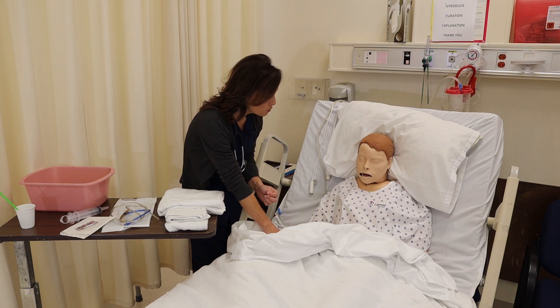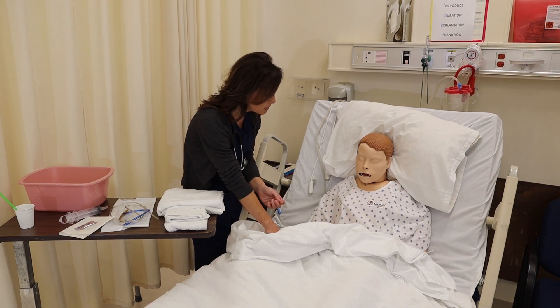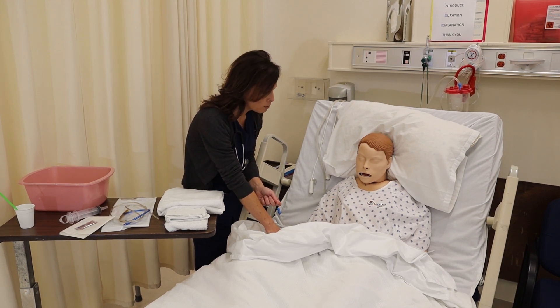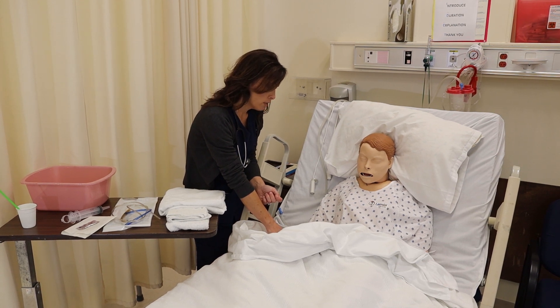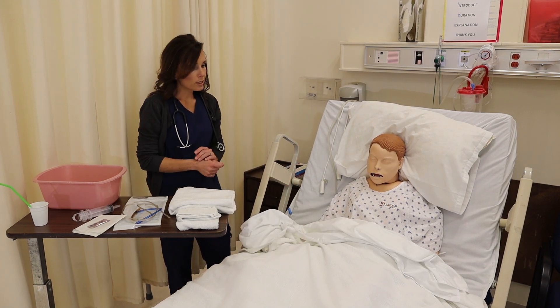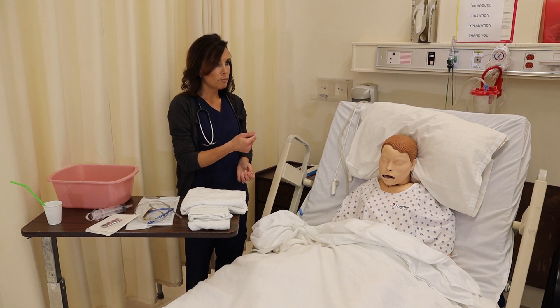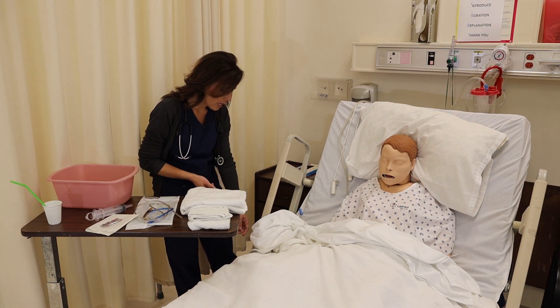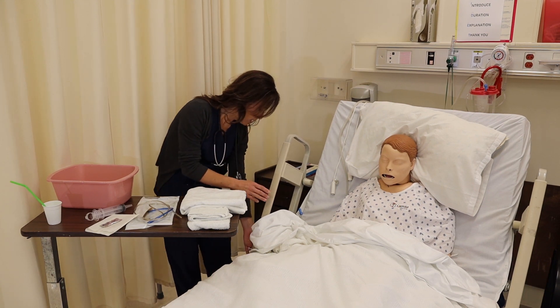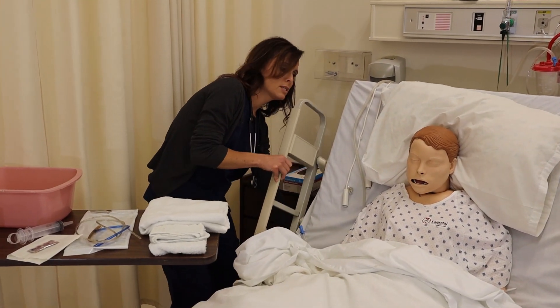Ms. Smith, the doctor has ordered for us to place an NG tube. You have a small bowel obstruction and we want to get all the contents out of your stomach to help you feel better and help the small bowel obstruction to resolve. It should not hurt, but it will be a little bit uncomfortable, but we're going to help make it as smooth and quick as possible for you. We're going to provide for privacy before we begin any type of skill by shutting the door or pulling the curtain around. We're going to make sure that we have the head of our bed up, and we'll lower our side rail closest to us.